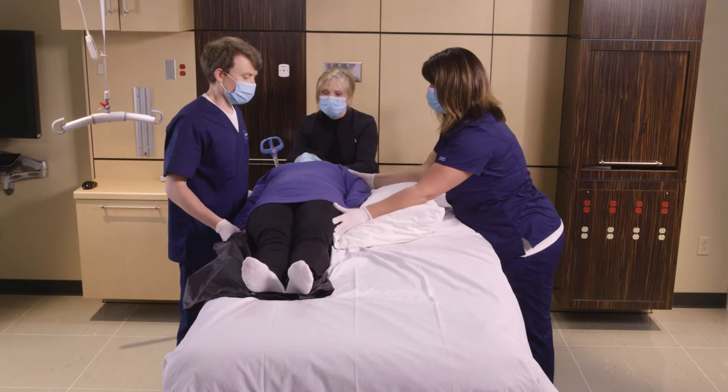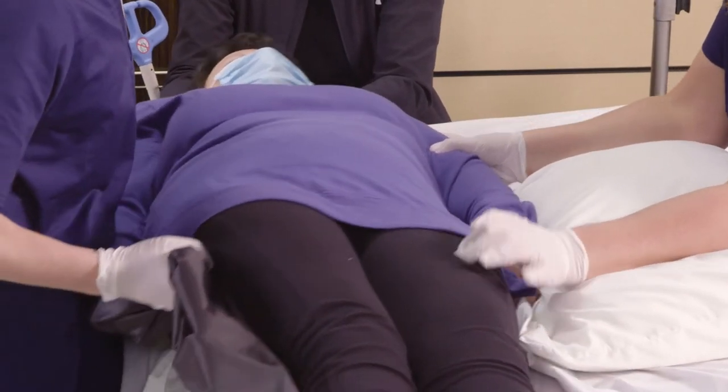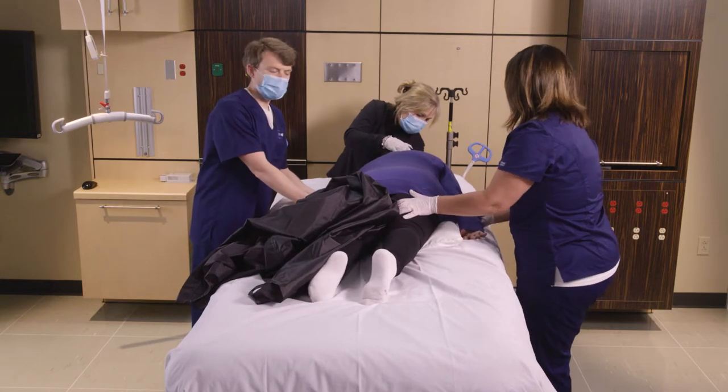Last, we're going to push towards me again and then rotate the patient. Then we're going to position the limbs.